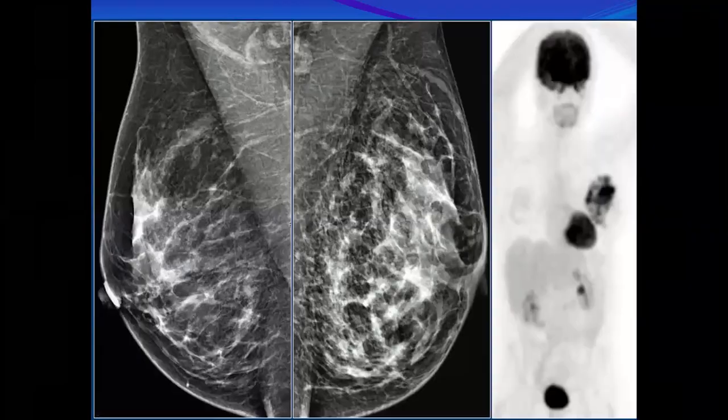So what are the differential diagnoses for global asymmetry? We described it before. Either malignancy, but commonly it is a normal variant. It can be inflammatory carcinoma, invasive carcinoma, and post radiation. Post treatment, yes, excellent. Post treatment, post surgery, post radiation, yes.